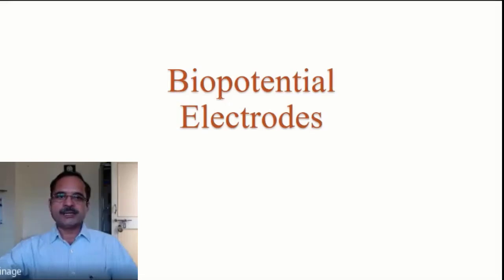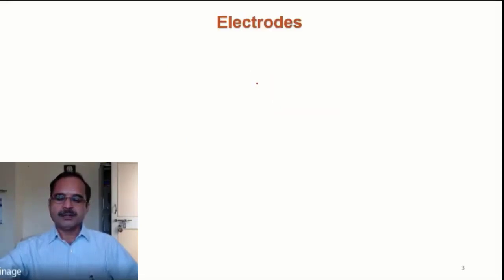Now the electrodes we are going to discuss are called biopotential electrodes, because we are using these electrodes to measure the potential generated inside the body. That's why the term biological potentials: the electrodes used for measurement of biological potentials, biopotential electrodes.